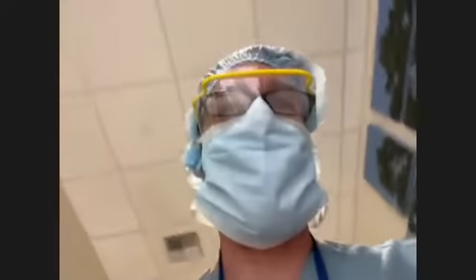We were discussing colonoscopies, right? We were fortunate enough to film a colonoscopy. And my first question is, what is a colonoscopy? What is it for? Okay, so basically a colonoscopy is a diagnostic or sometimes screening test used to try to identify pathologies within the inner lining of the colon.